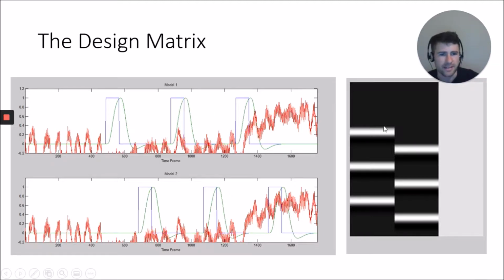What you see on the right is actually the same information, but in a more simple format. The first column's the left hand finger tapping, the second column's the right, and these white bars are actually when the model peaks. And what you notice just following the white bars is an even darker shade of black, which is this dip, this overshoot after the model returns to baseline. And again, you go left, right, left, right, left, right. There is a third column, which is known as the control. The controls, I've actually never seen it used, but it's there to basically regulate, as is what I've been told.